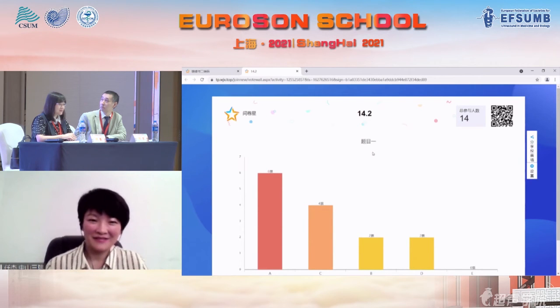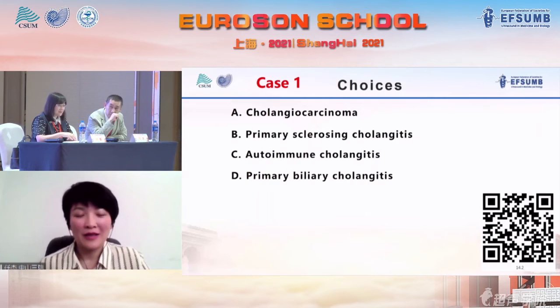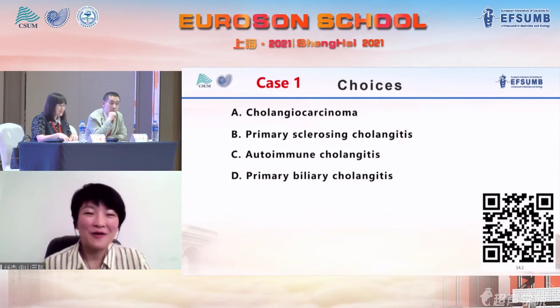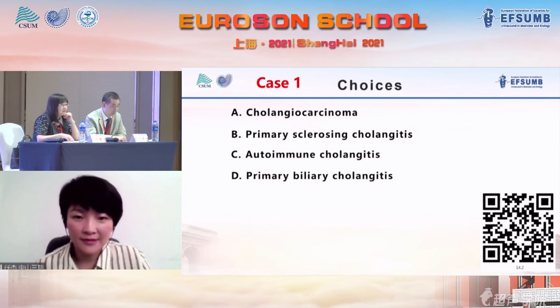Most answers are A, cholangiocarcinoma. But before I tell the answer, we can see another result. Please next slide.